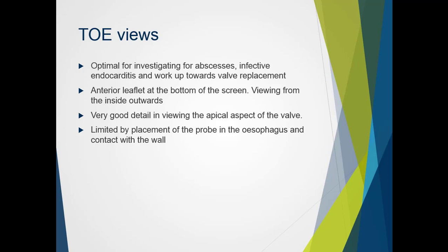Moving the probe, the user can visualize the mitral valve from a long axis and short axis view. Transesophageal imaging is limited by the placement of the probe in the esophagus and contact with its wall. This is different to transthoracic echo, where the entire chest can be utilized.